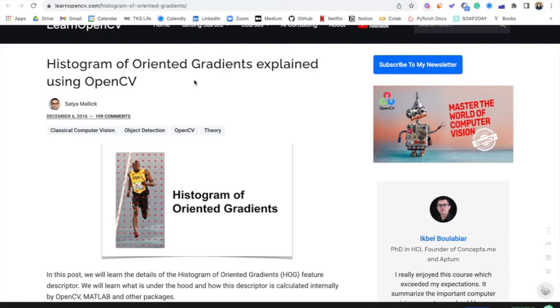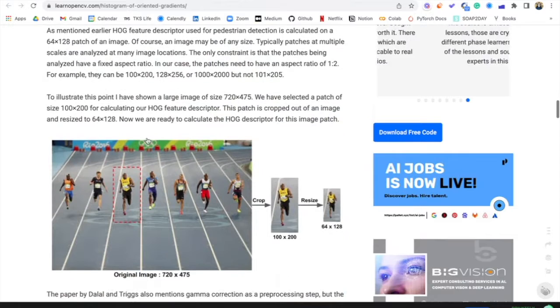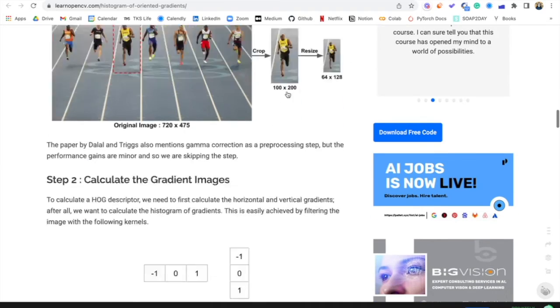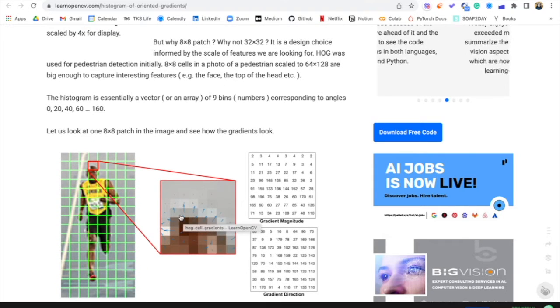This algorithm is trying to distribute the directions of the gradients that are used in the features. You can see there are some arrows, and we'll look into how this works. First, you need to know that the reason gradients of an image are helpful is because the magnitude of the gradients is so large around the edges and corners. If you look at the size of the arrows here, it's much larger than these small arrows over here. If the magnitude of the gradients is very big, you know there's some sort of edge or corner here because of the larger and abrupt intensity change in the gradient features.